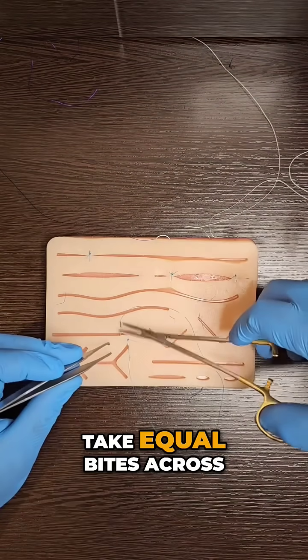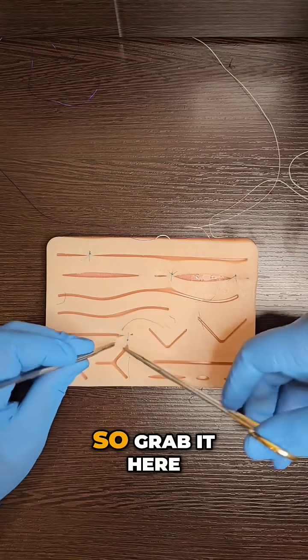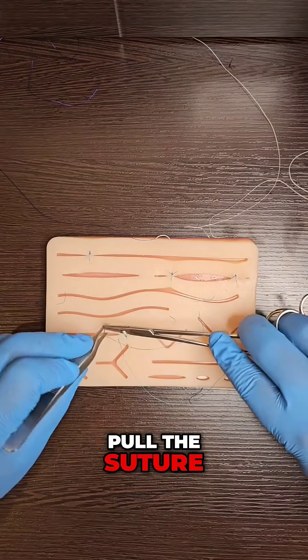Take equal bites across both sides. I know that I need to mount the needle every single time, so grab it here, mount it how you want it, pull the suture, keep on suturing.